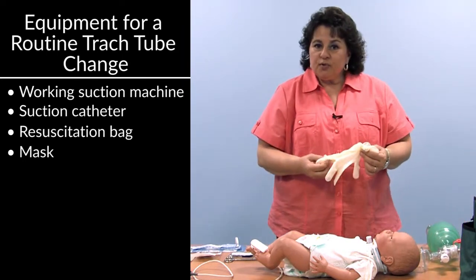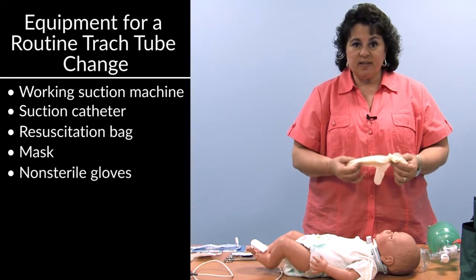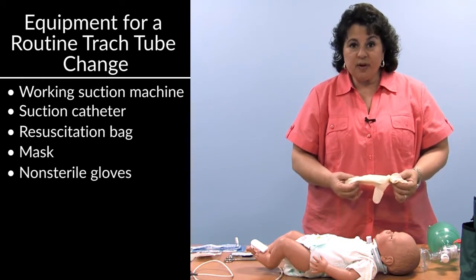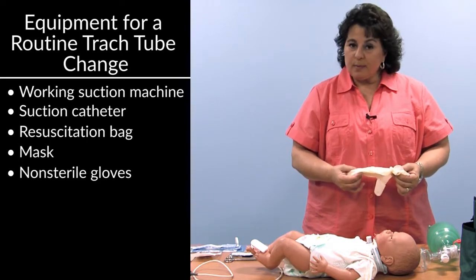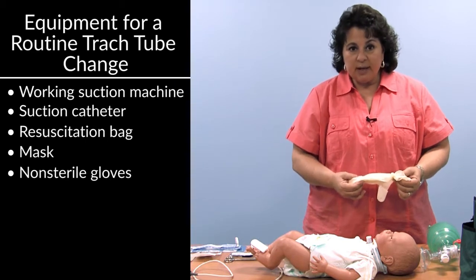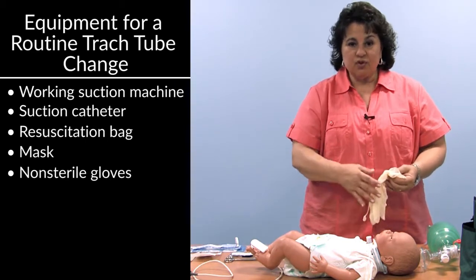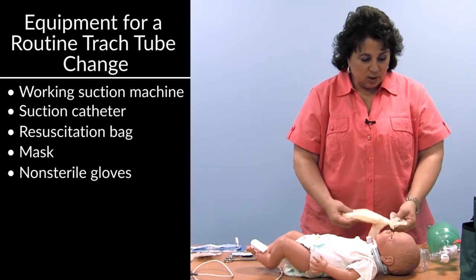The tracheostomy tube change in the home is considered a clean procedure, so I have non-sterile gloves here. The tube itself does come sterile from the manufacturer, as it is an implantable device, so we will not touch the part that will be inserted into the child, but we will use non-sterile gloves.